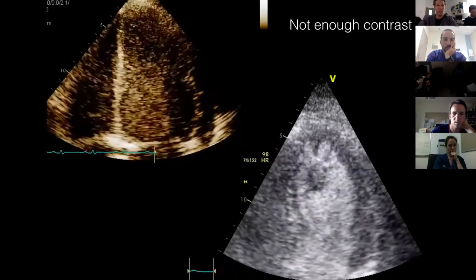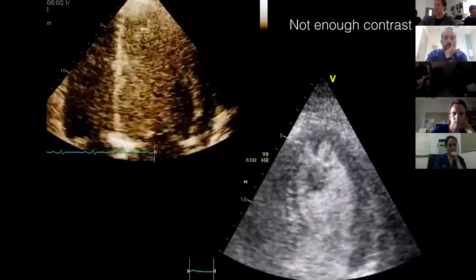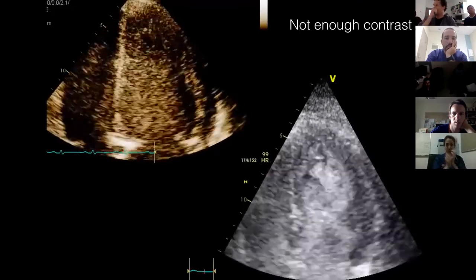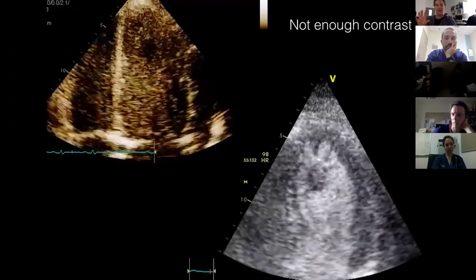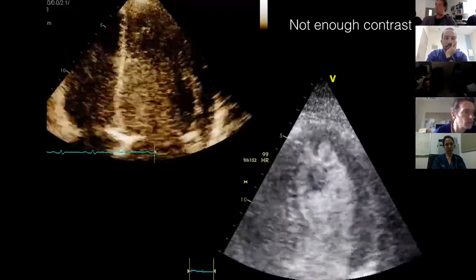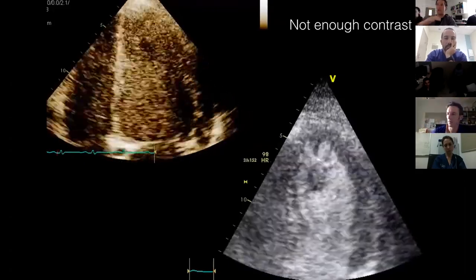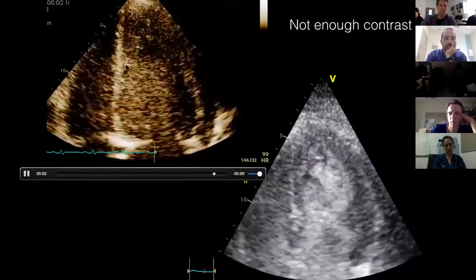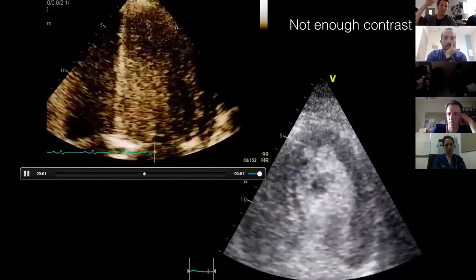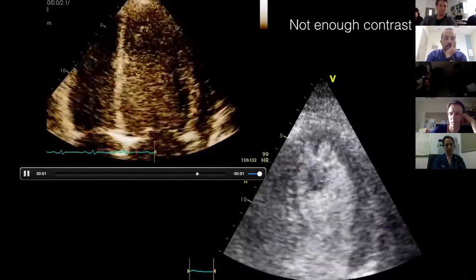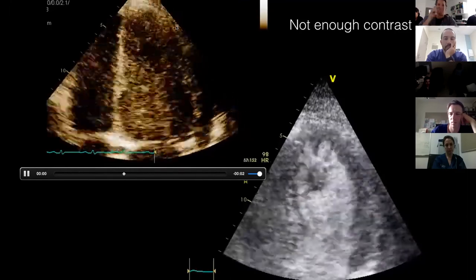False positives from incorrect settings: if you forget to turn the power down — forgetting to set the low mechanical index preset — and inject contrast at standard settings, you can see apparent filling defects at the top of the LV. That's simply because the high ultrasound power is destroying the bubbles as they come in, creating a false appearance of a filling defect.